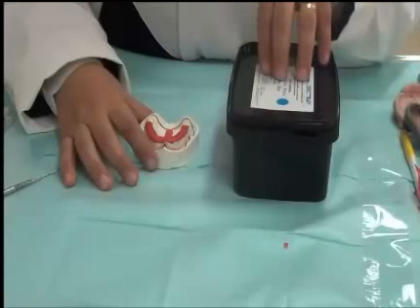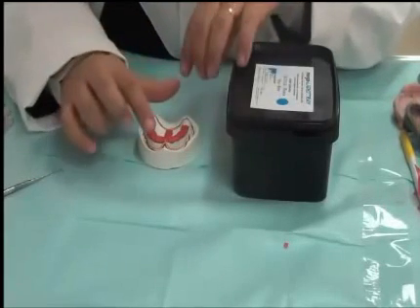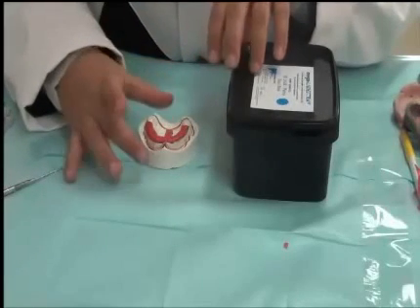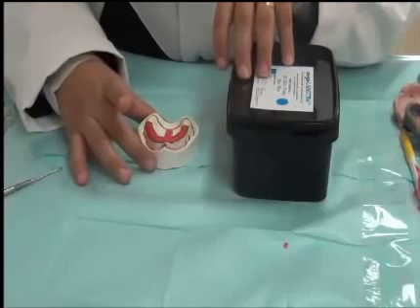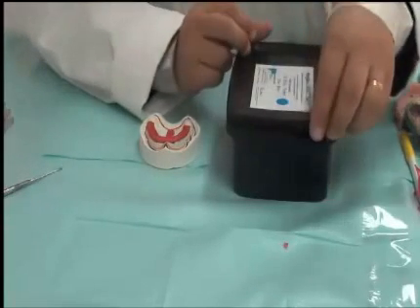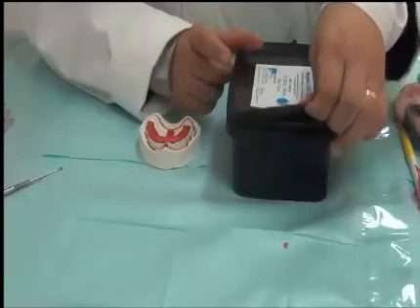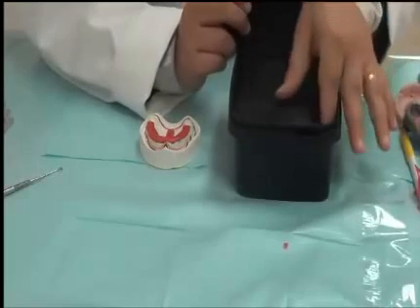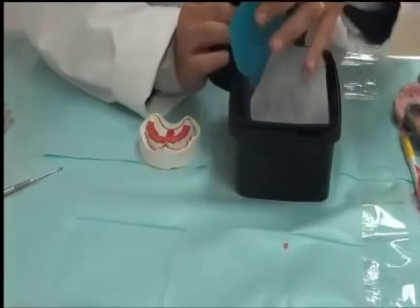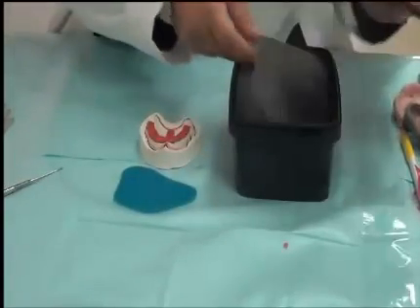For students' purposes, we use the light cure because it has the advantage that it's workable for a long time. You can work, you can modify, you can add and remove while still having time. And once you have finalized your shape, you can light cure it to become solid. So it has more working time. Light cure material comes in a light-proof box, and it is also sealed with multiple sheets to protect it. So this is called light cure material.